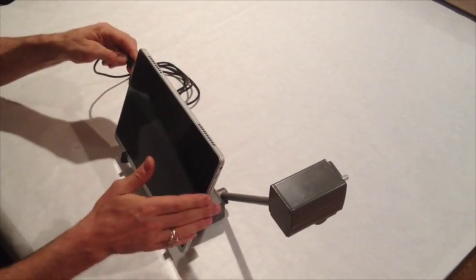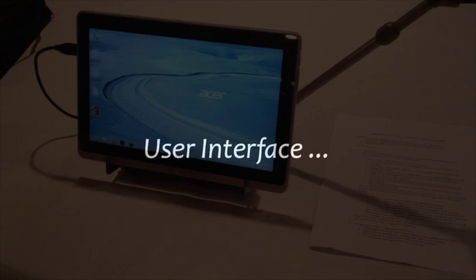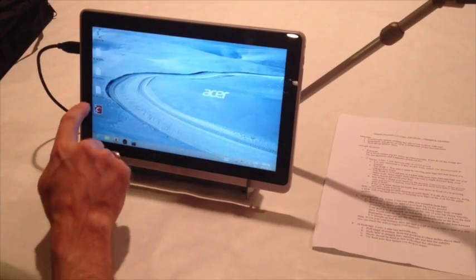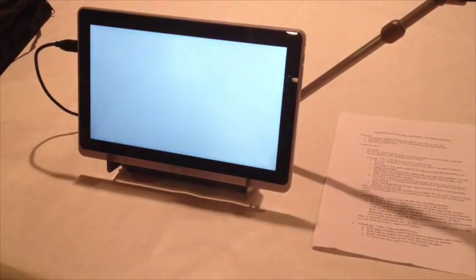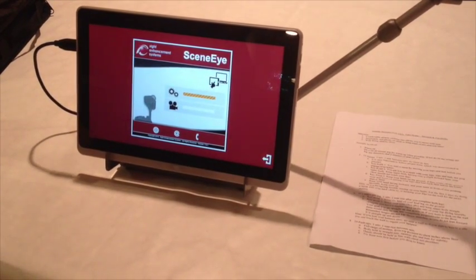The user interface for the SceneEye-500 could not be more intuitive. We've designed this for use with a touch screen interface, either a tablet or a laptop. Of course, it can also be used with a mouse or a keyboard.